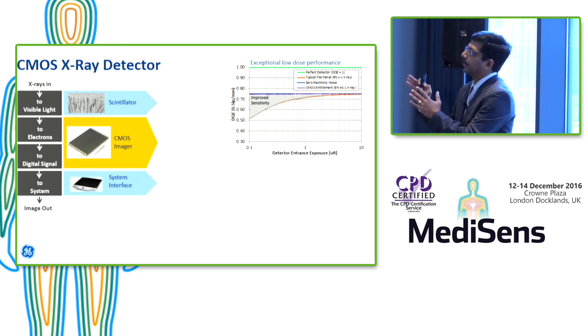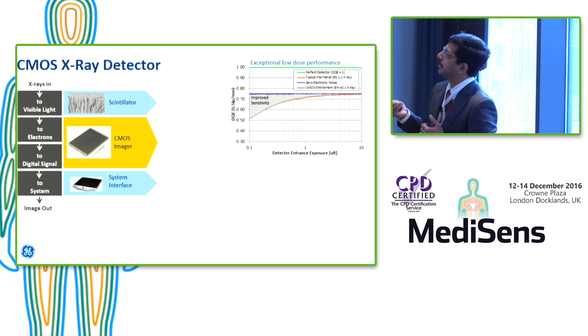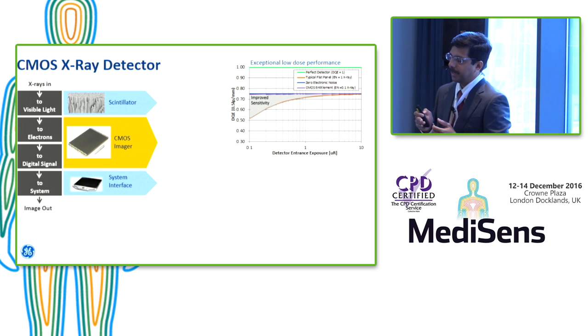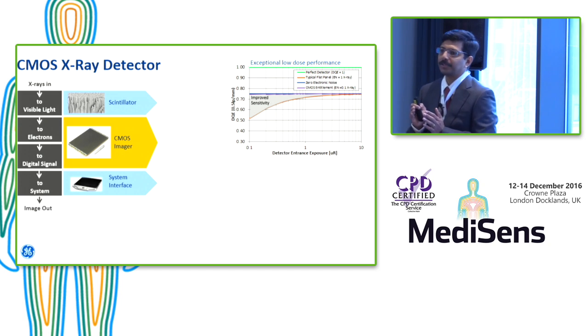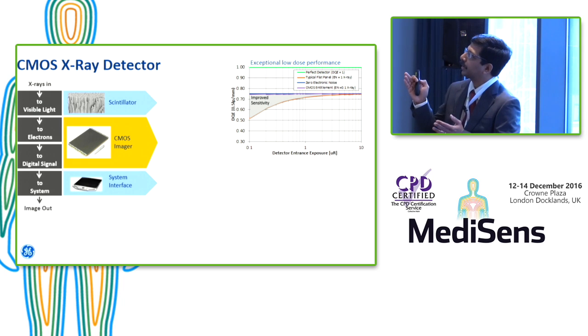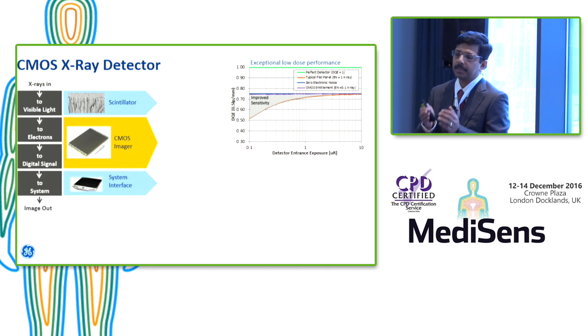And I'm showing the entitlement, so again, for exceptional low noise performance. What I'm showing here is if you put a CMOS detector out there, from an entitlement perspective, to achieve a 0.1 X-ray noise, what does it mean? One important thing to remember is when you talk about X-ray detectors, we're not interested in light photons or electrons. We're interested in X-rays. So everything has to be converted into X-rays. And the conversion unit from the electrons to the X-ray is determined by the scintillator. How many electrons are created by one X-ray photon? So in that unit, we have about 0.1 X-ray. That is possible with CMOS compared to 1 X-ray in TFT.